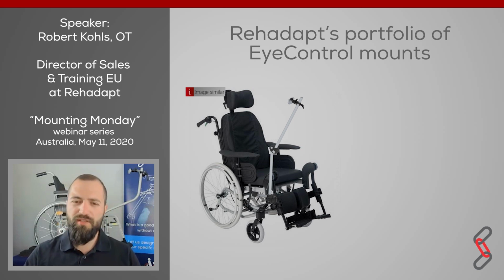But when would you choose what kind of solution for what kind of customer? You can choose the system depending only on the total weight of the communication system. But when we see a wheelchair like in this example, in my experience a lot of people with a heavy brain injury, or people with ALS most of the time, are using it. They also use the seat tilting functionality. And when we want to use a heavy duty arm on a wheelchair like that, we could get in trouble in terms of the wheelchair construction.